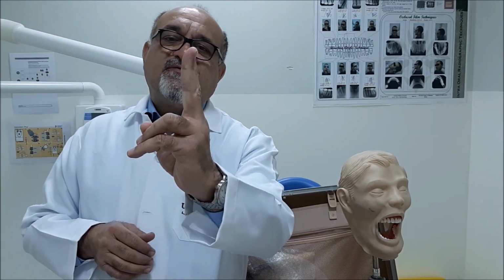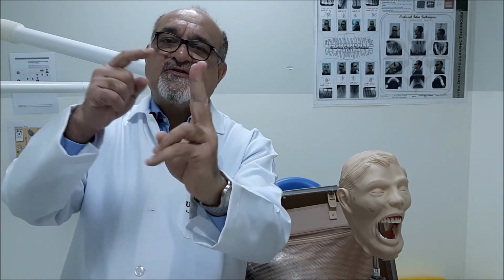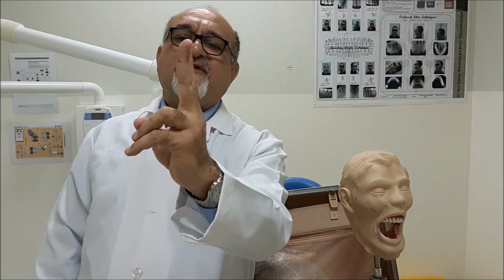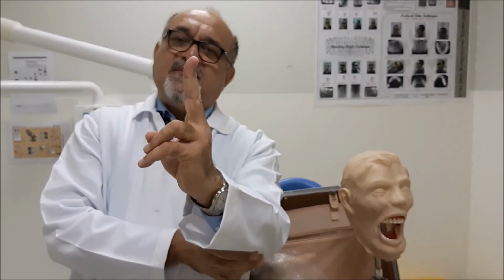In order to understand the tube shift technique, I will demonstrate it to you before we start into the process of the technique. I want you to put your fingers just in front of your eyes, so that your index finger will cover the middle finger. Try to have a look at them.